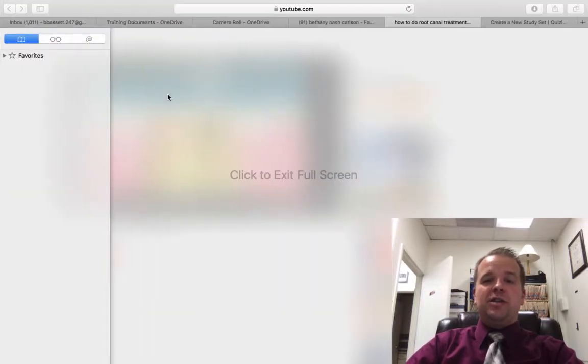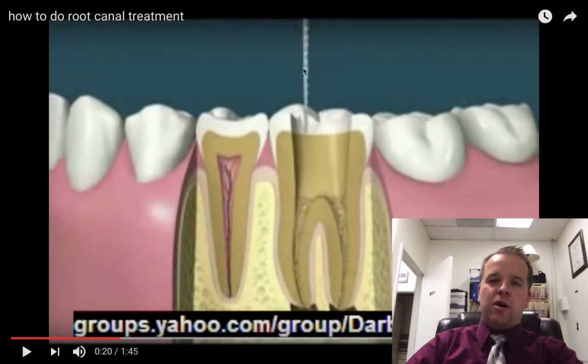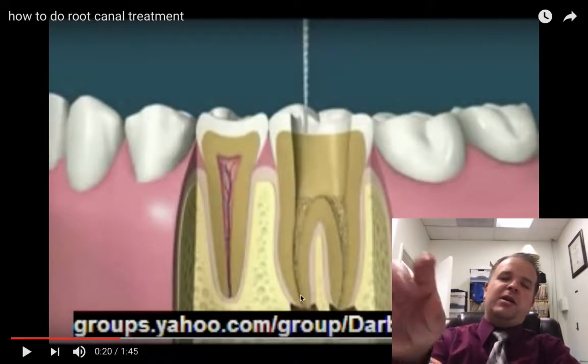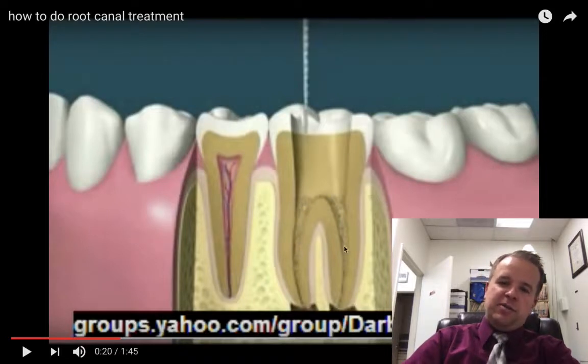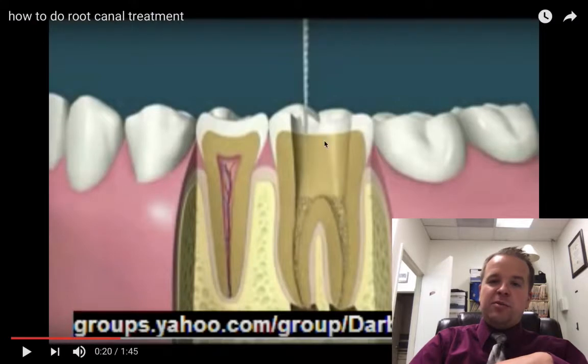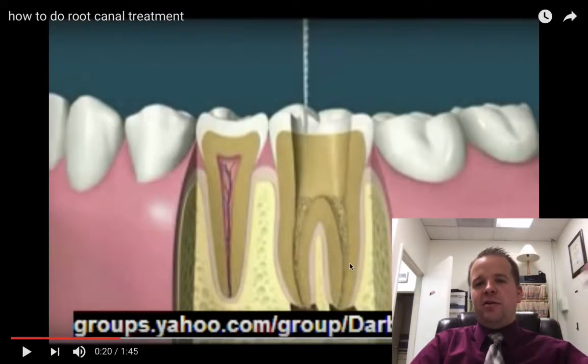So what you'll see is this really long file that will go all the way down to the end of the tooth. And this is used in a small little drill. And they'll go slowly but surely all the way down. They'll start here and it'll start getting tighter. They'll go down a little bit and then you'll come out and then you'll irrigate some more. You'll come down and do some more cleaning out of the tooth and then you'll irrigate some more.